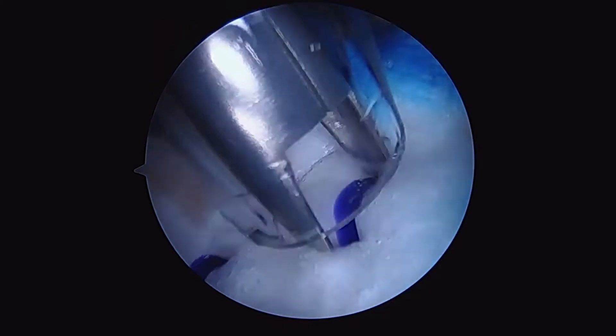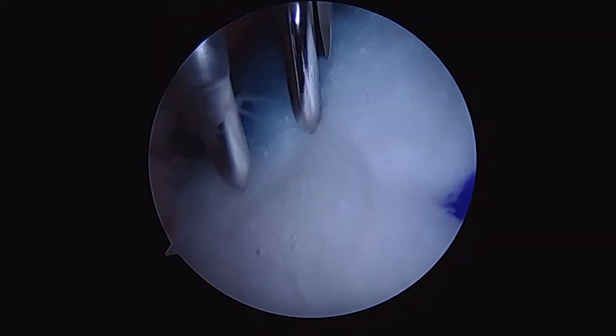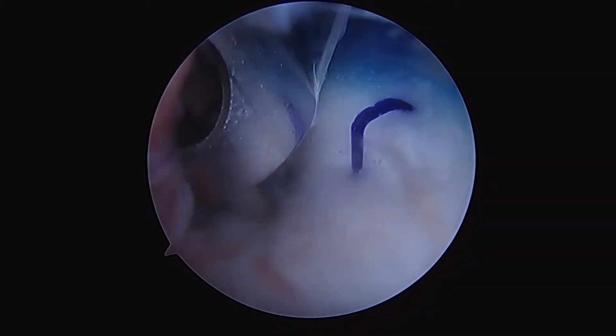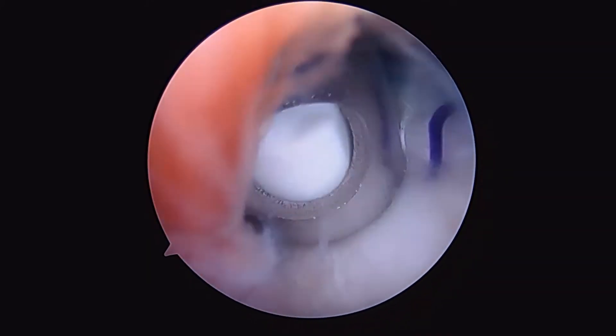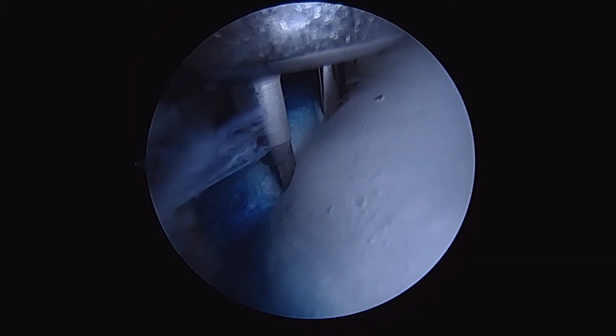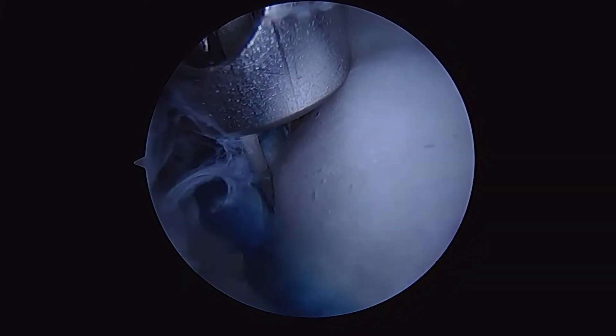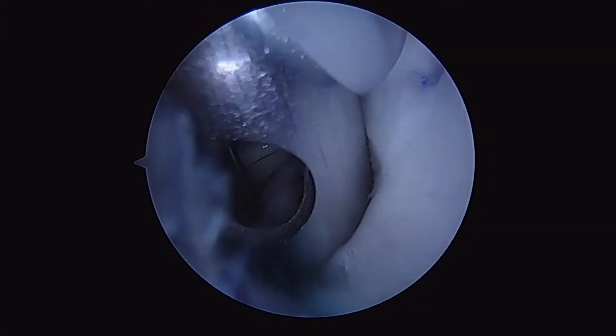Now that we've managed to secure the rotation angle that we like, we'll put our non-absorbable staples laterally. We're at an angle, so we're going to rotate the arm again to make sure we're optimizing our angle. We're also going to try and bring the graft around the edge at the lateral aspect of the humerus as far as we can to get good coverage of our footprint.